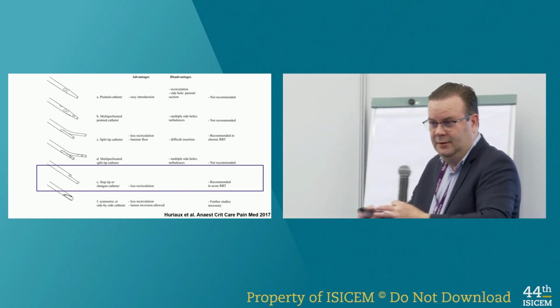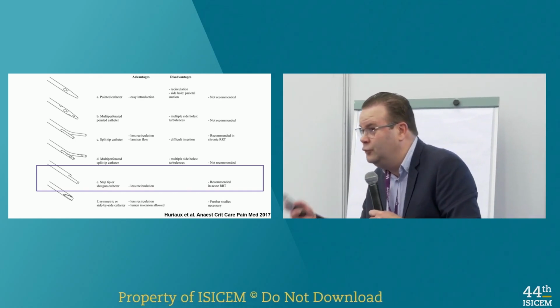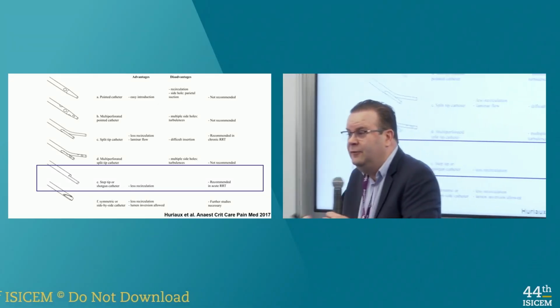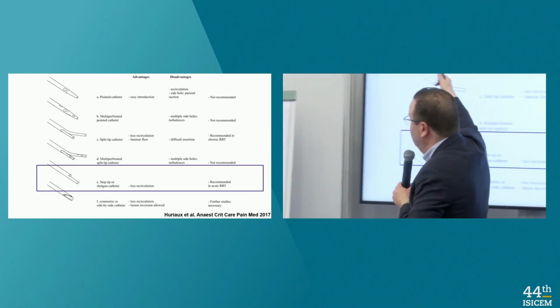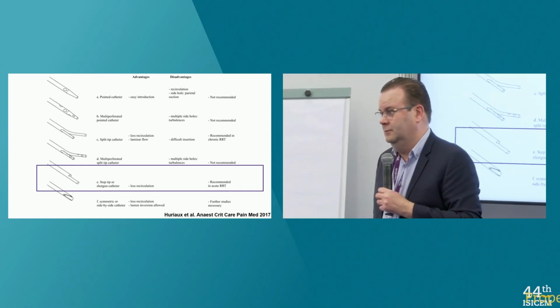This is the entrance hole, the proximal holes. You have a lot of turbulent flux, and then there's going to be a lot of clotting here. And by the way, when I was removing these catheters, I was looking at the catheter, and all the holes here were clot, right? Because of the turbulent flux.